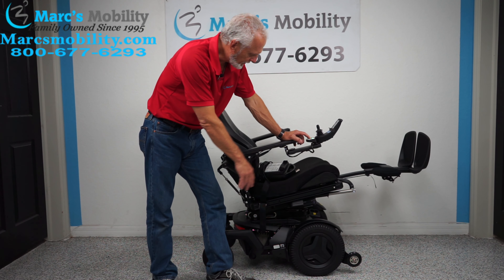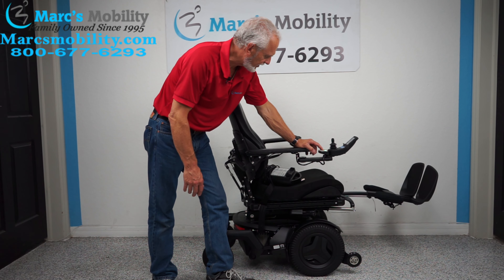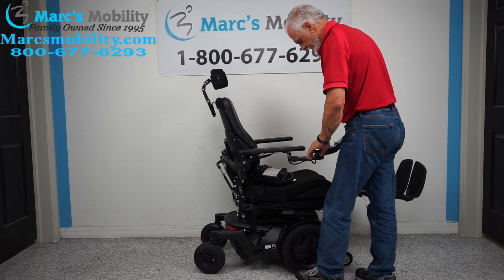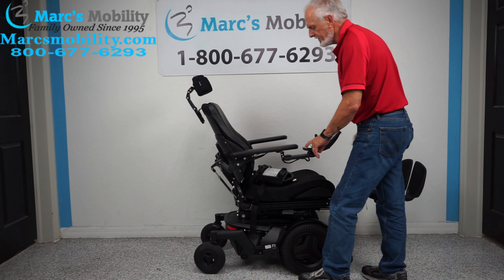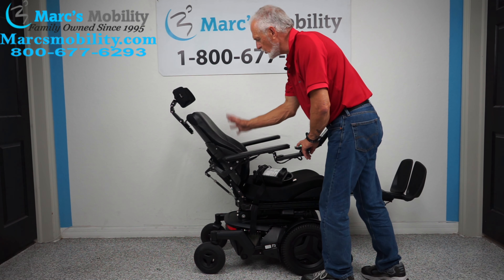I'm going to bring the tilt all the way back down. The last feature is the recline — I'm going to make the back go back. If I hit the right button, so now the back is going back. This is called electric recline. Nothing is moving in the chair but this back portion going back.